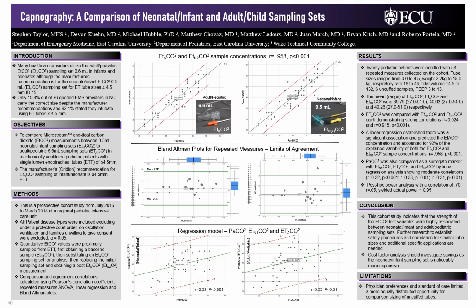In conclusion, the adult sample sets are highly associated and comparable to the neonate infant sets. Further studies may be needed on the safety and settings and limits where physicians preferred.